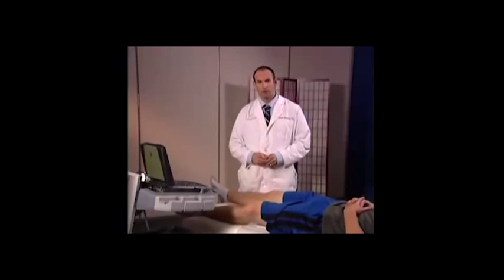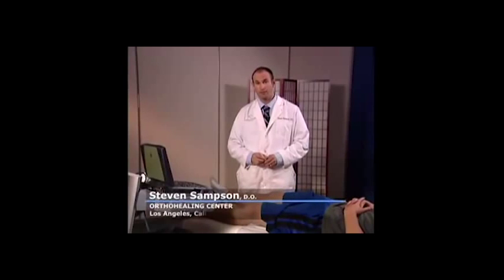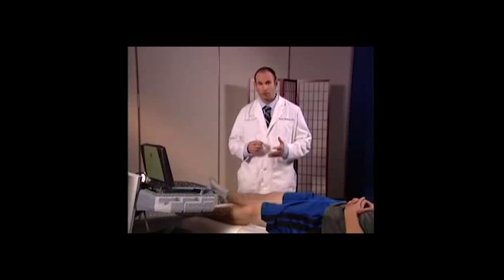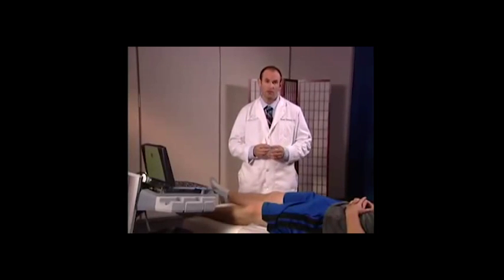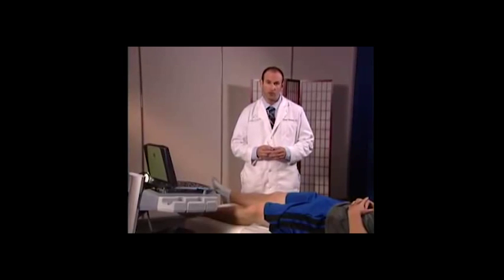Next, we're going to review injection of the knee. Before we get started, keep in mind that this is just a demonstration, and normally these are performed under sterile environments with betadine and prepping the area properly. This is just an idea to show the physician exactly the approach that we use in doing injections with the proper needle placement and approach.